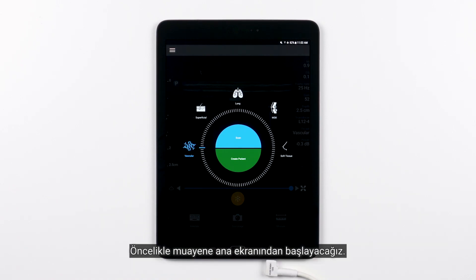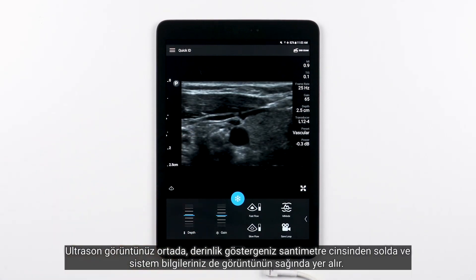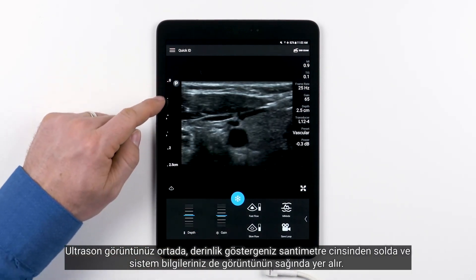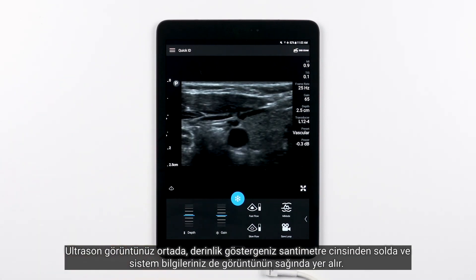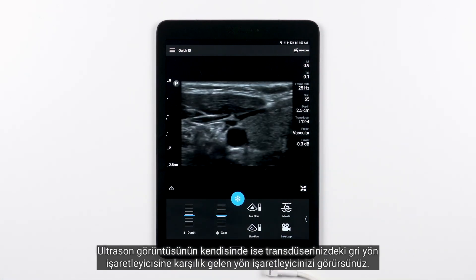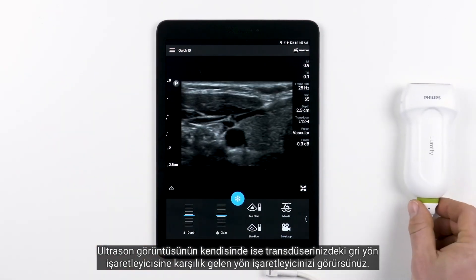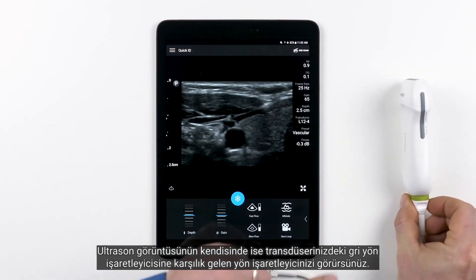We're going to start from the exam main screen. First hit Scan. Once you are actively scanning with your Lumify system, this is what you'll see. You have your ultrasound image in the middle, your depth indicator on the left in centimeters, and your system information on the right-hand side of the image. On the ultrasound image itself, you'll also see your orientation marker, which corresponds with the gray orientation marker on your transducer.